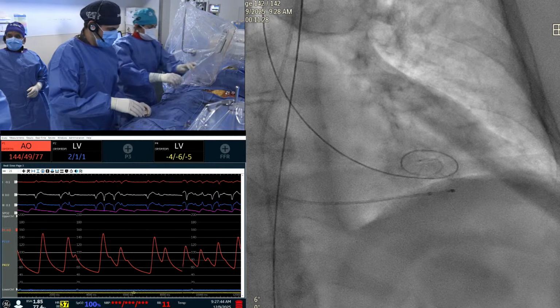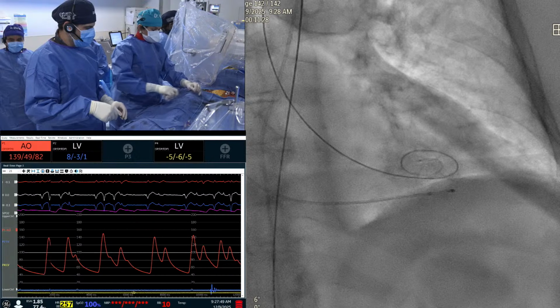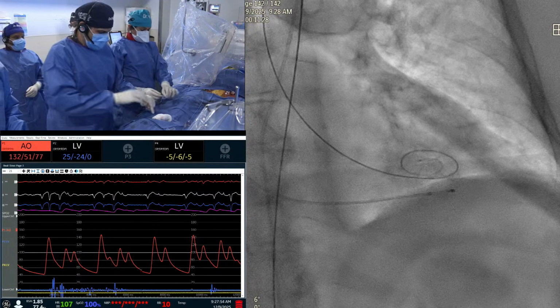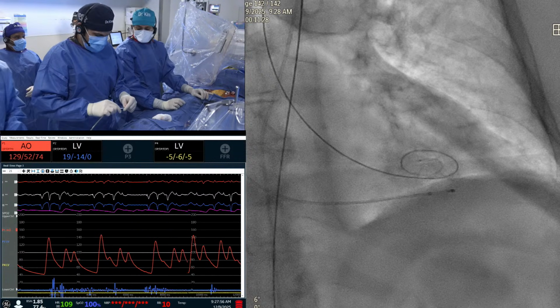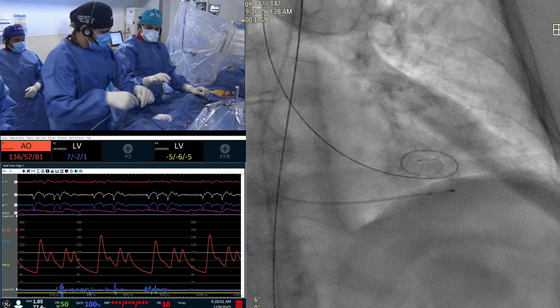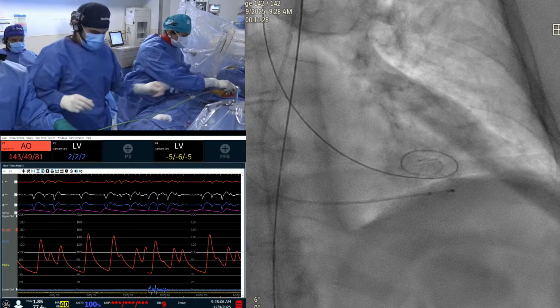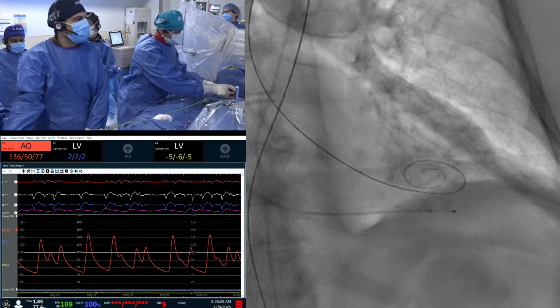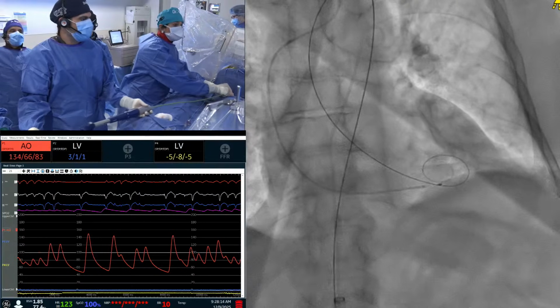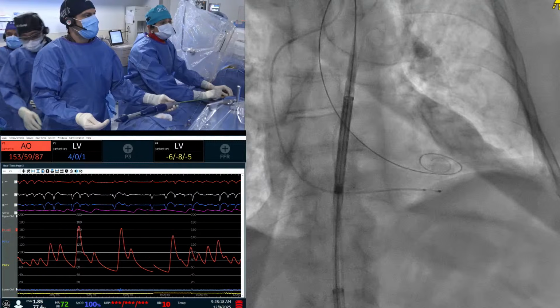The other point we want to talk about, Dr. Sharma mentioned the area and dimensions calculation on CT. Let's say you want to put in a balloon expandable valve for whatever reason. This valve will be underexpanded when you do a CT. 21 millimeter is the average dimension. A 23 balloon expandable will become a 21 only. That will increase HALT, what we've seen in the literature, and also potential early degeneration. So just beware of some of the limitations. You cannot stretch a balloon expandable to a 23, no way. You'll just rupture the root. So just beware of these kinds of differences when we do these procedures.